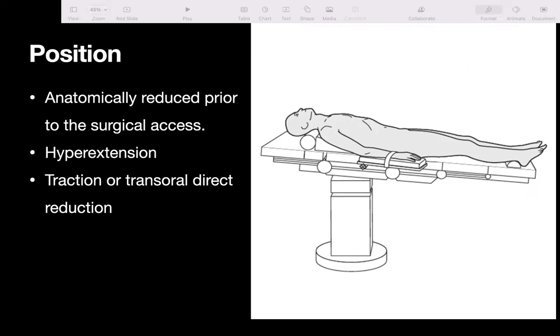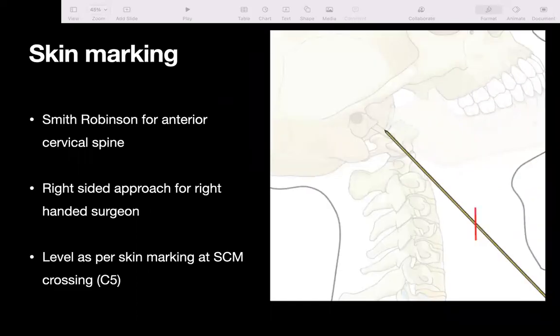For reduction, one may rely on traction or transoral pressure. For traction, we can use Gardner-Wells tongs or a Mayfield head holder. Skin marking is done by placing the guide wire over the skin, taking a C-arm shot, and marking at the level where the guide wire crosses the skin at the anterior border of the sternocleidomastoid. This guide wire should be placed at the ideal trajectory of the screw, usually at the C5 body level.